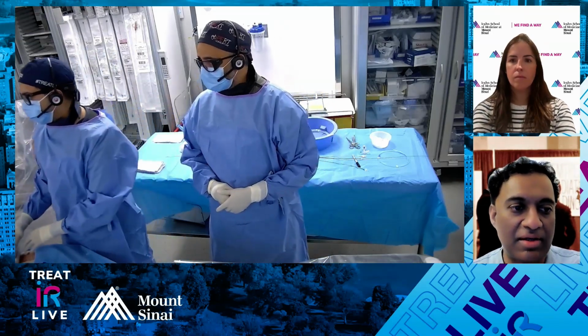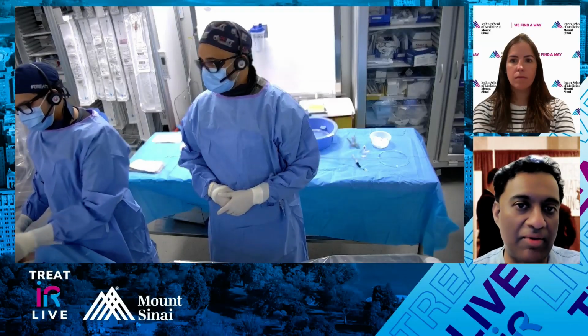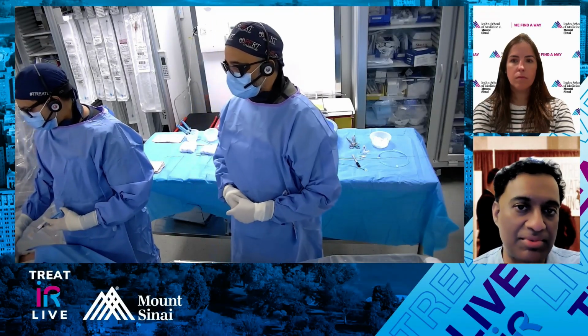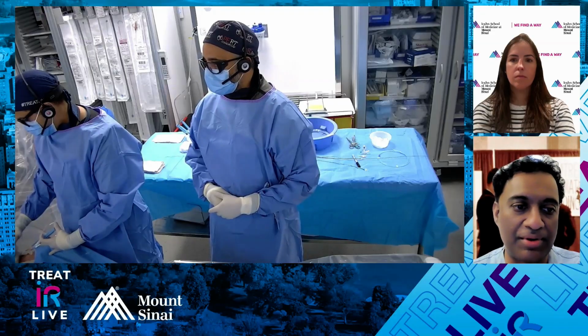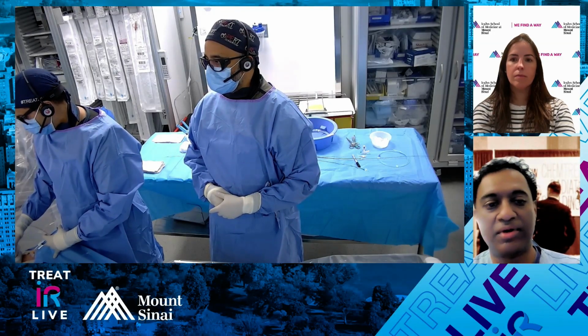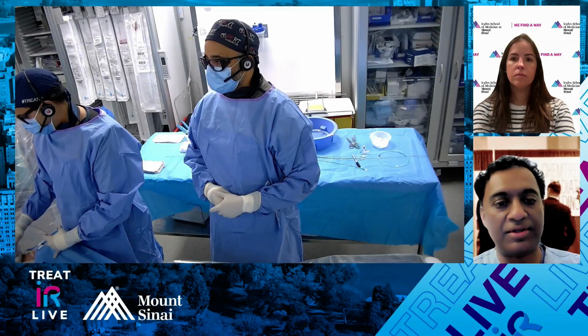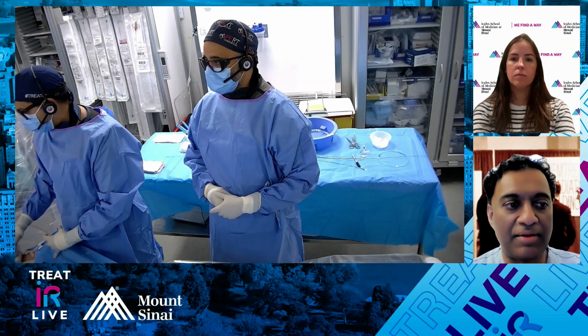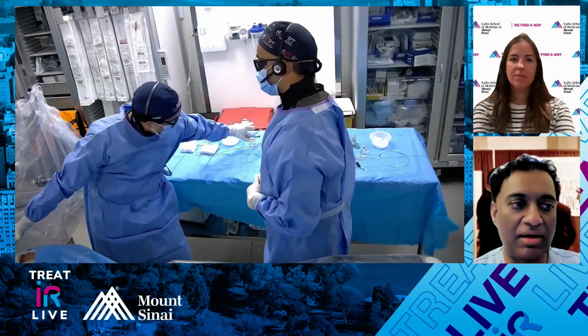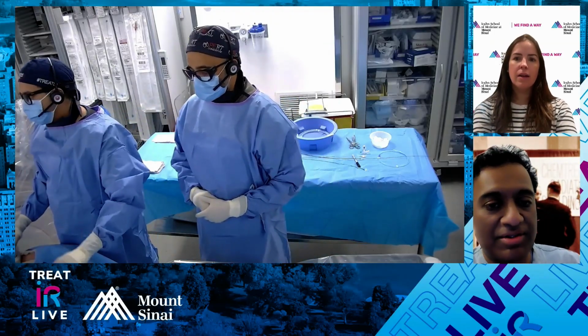So you definitely need to follow them. They're going to degenerate. So now we have devices both distally, but even now proximally, that we can fix these paravisceral components or thoracic components. So it's good to have new endovascular options instead of open repair for these. But yes, it is the bane of endo, but even open has degeneration as well. So it's not free, but yes, definitely have to surveil these.